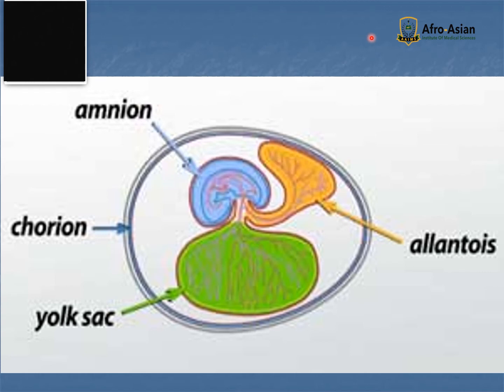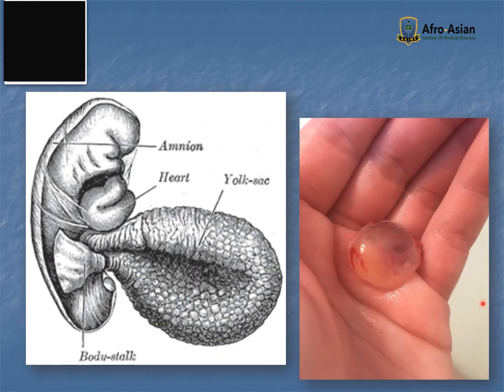The yolk sac is the extra-embryonic membrane that surrounds the egg yolk. Here you can see the yolk sac, the embryonic heart, and the amnion. Another question arises: can there be a yolk sac and no baby?